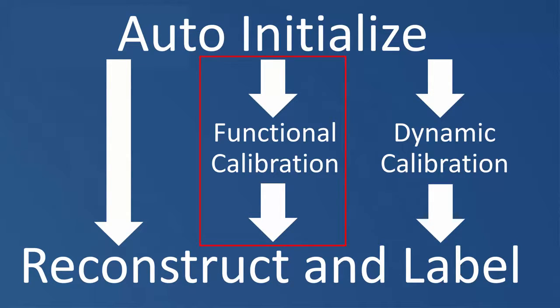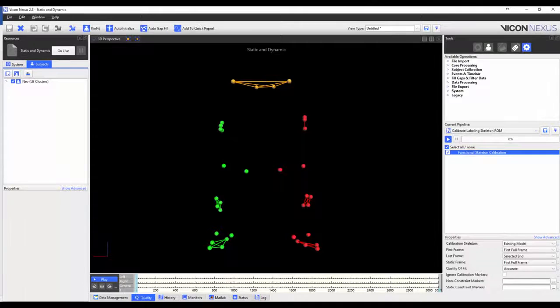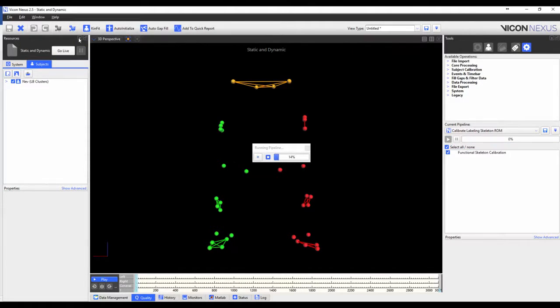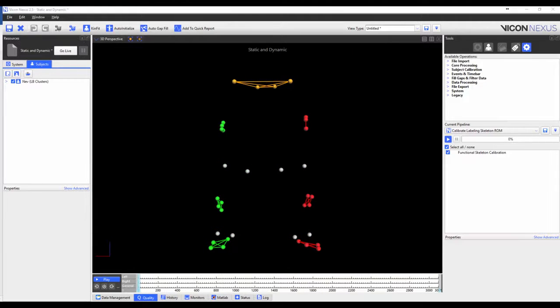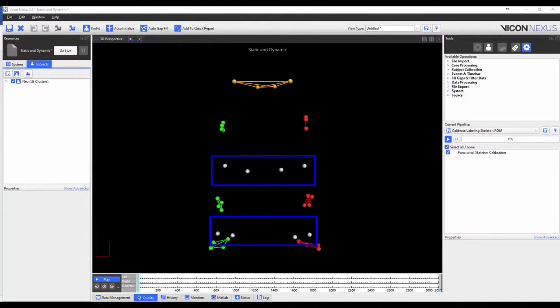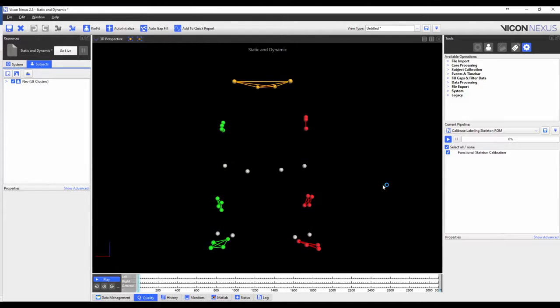I'm now going to show you how to use the functional calibration to reconstruct and label dynamic trials with larger ranges of motion. We would still run the auto-initialized labeling pipeline using the exact same steps that we have performed earlier in the video. I have already loaded the combined static and functional calibration trial. If we had captured a separate functional calibration trial, we would load that one instead. Now I'm going to run the reconstruct and label pipeline operation. The reason I am reconstructing and labeling a trial that had already been labeled is so that I can use the static calibration to auto label this functional trial, which will help with the labeling. You will notice that the knee and ankle joint markers aren't labeled, as these were calibration-only markers. This is okay, as they were physically removed from the subject and aren't in any dynamic trials, and they've also been removed from the VSK.